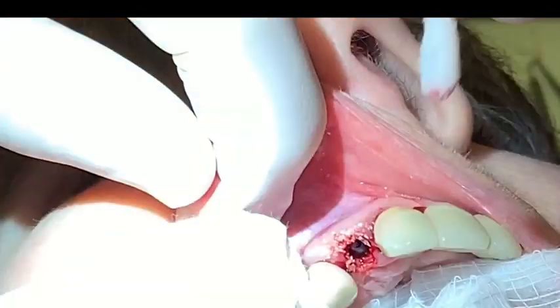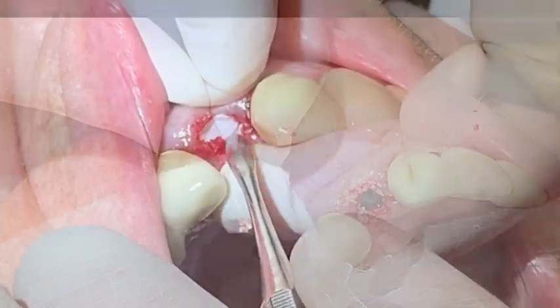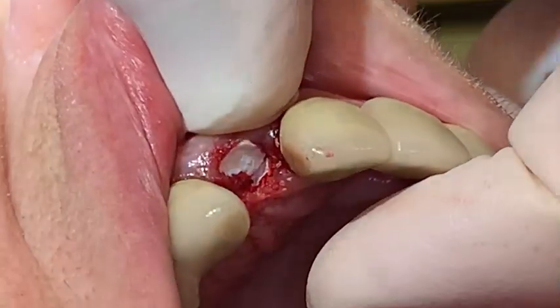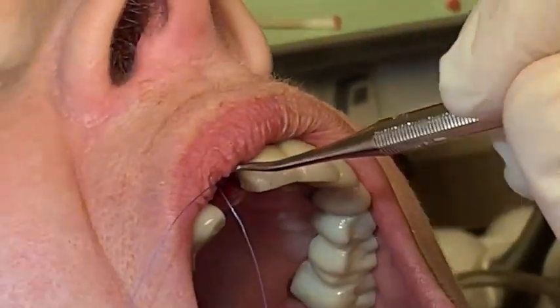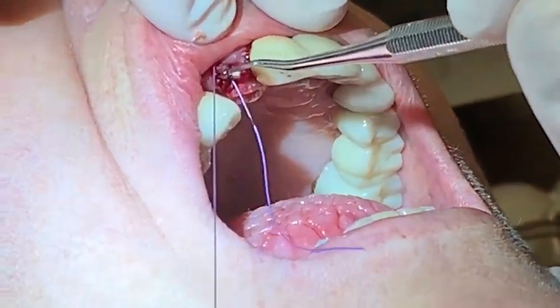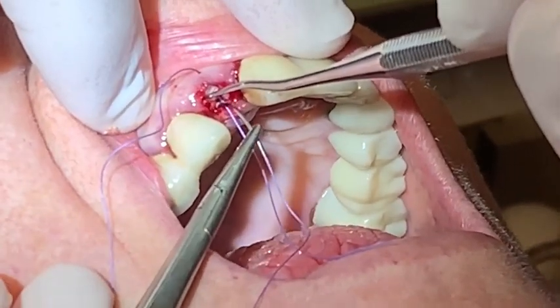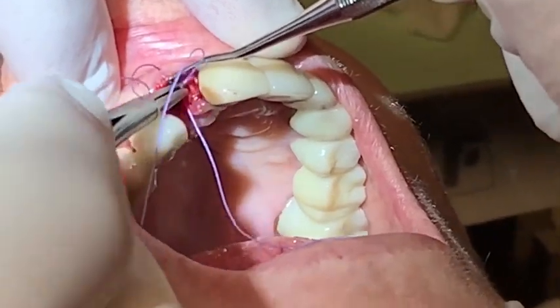Cadaver bone grafting material was placed in the space between the implant and the labial bone, followed by a resorbable collagen membrane. 4-O-Vicryl was used to secure the membrane into place during the healing phase. The assistant aids in keeping the membrane in place while the suture is tied off.